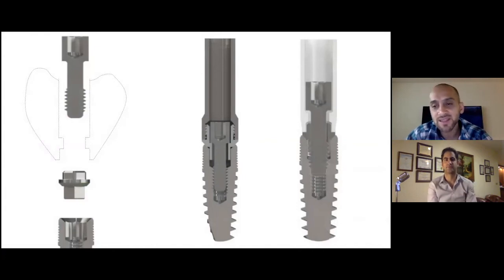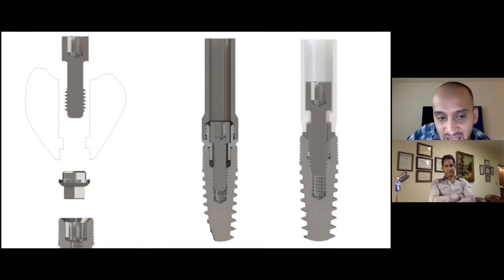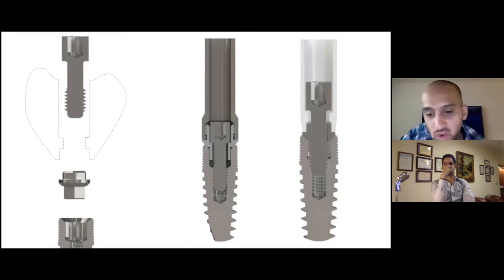But Omid, here's a slide that I want you to pay attention to. It's very important. So look at the image on the left. The first image on the bottom is the implant. Then on top of that, that's an engaging passive abutment for an internal hex implant. And the way that implant prosthesis is retained to the implant is the clamping effect of the screw on top.